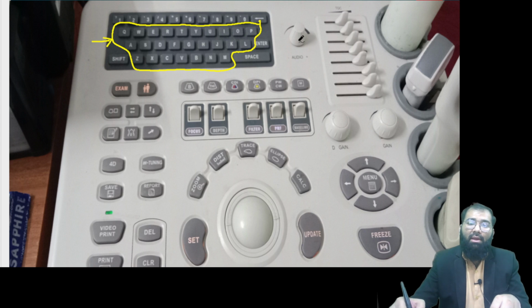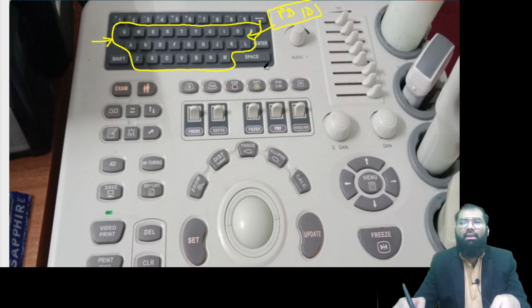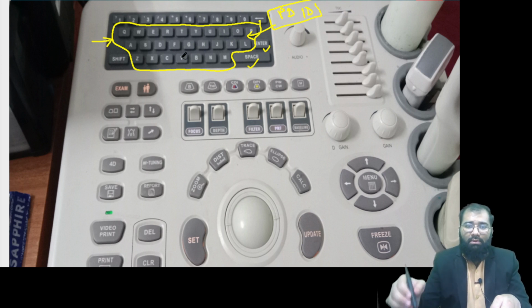So whatever you make, the patient ID, once you start making a new patient ID, all the typing part would be taken care of by this. So you have got a spacebar key, enter key, shift key, and all the alphabetical keys. Again, you can make it small or capital letters depending upon these keys.